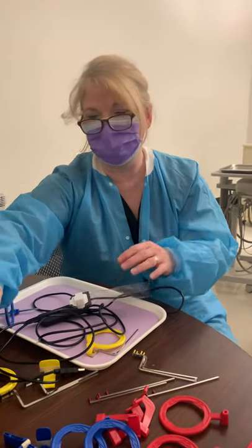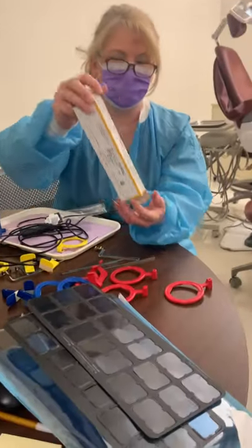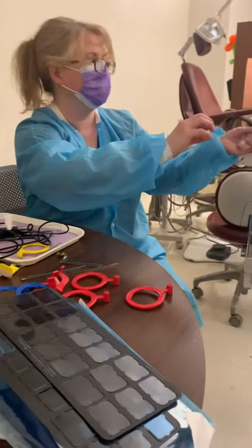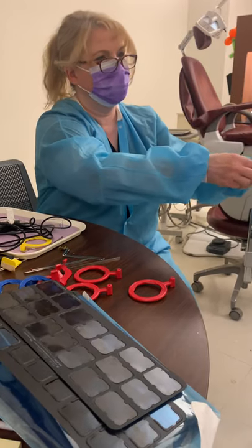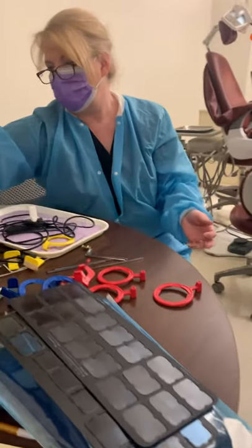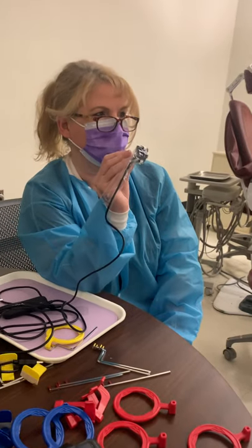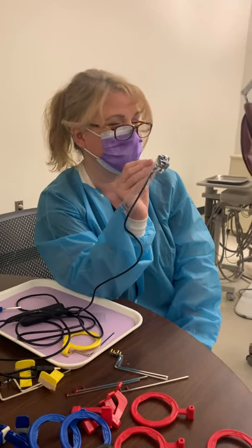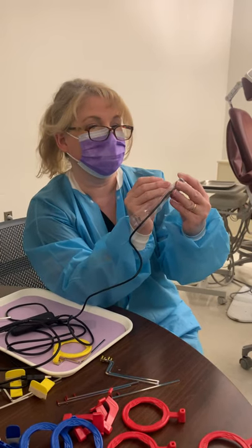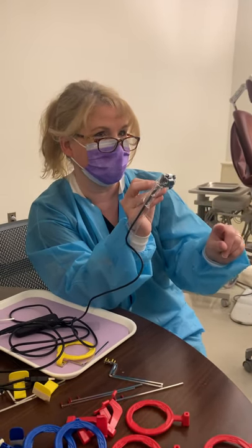There are many different types of bite block systems for sensors. With your PSP, what's nice is that you can use a regular bite block that you would use with film. This is what film looks like — film is really thin. When you get an opportunity to touch the PSP, you're going to see that they're just as thin. Look how bulky the digital sensor is — it's difficult to get in patients' mouths, which is why sometimes doctors won't choose sensors. Sensors tend to have a clearer, more digitized look to them than PSPs, though other doctors say they see no difference.